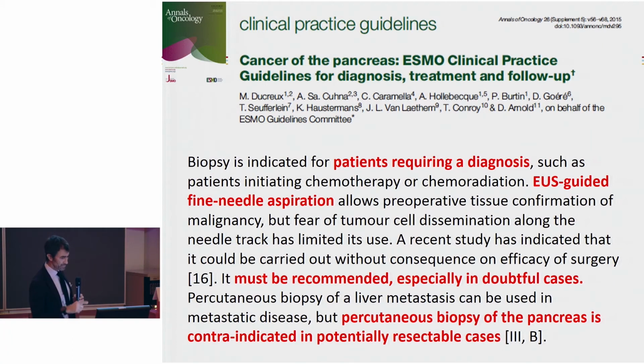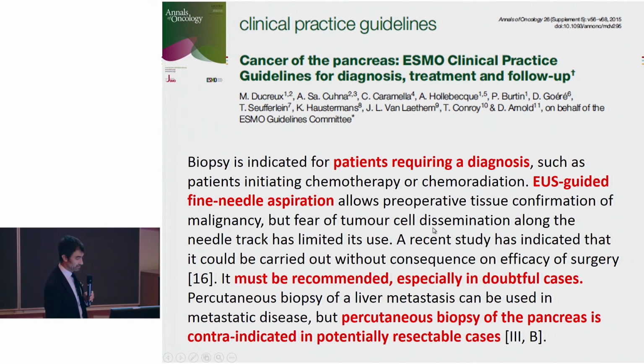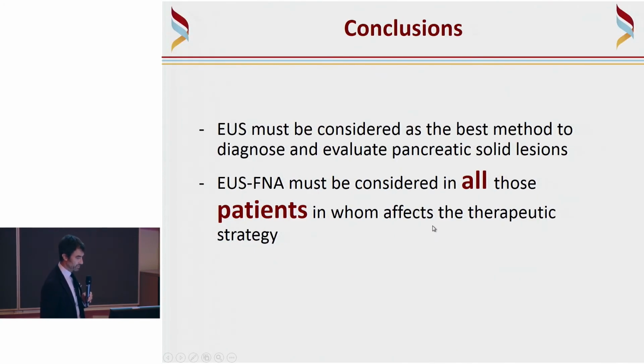treatment. And this is why the ESMO, the European oncologist guidelines, show in their conclusion that EUS-guided fine needle aspiration must be recommended in patients with pancreatic solid lesions, especially in doubtful cases, and percutaneous biopsy of the pancreas is contraindicated in all potentially resectable cases.